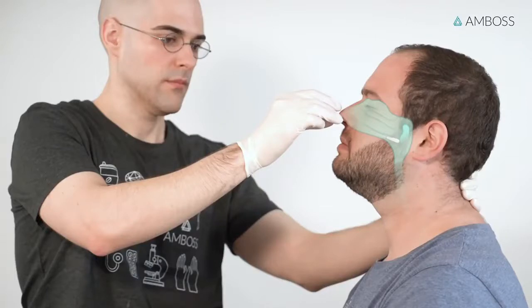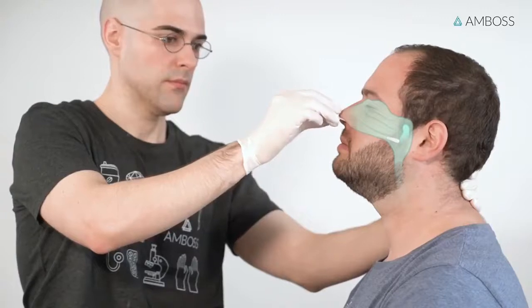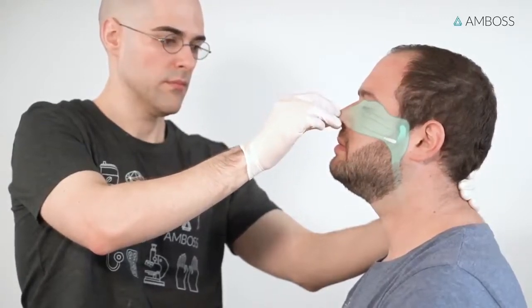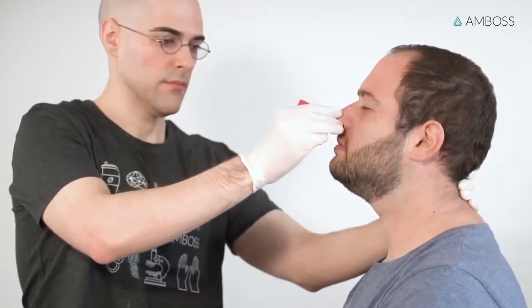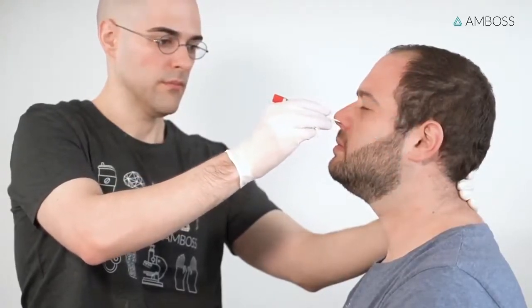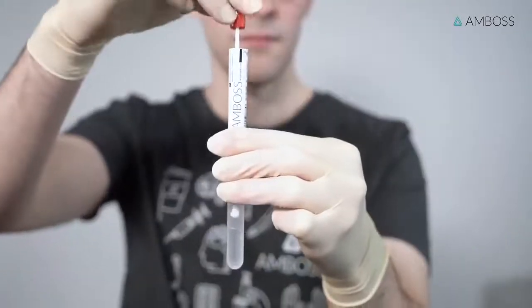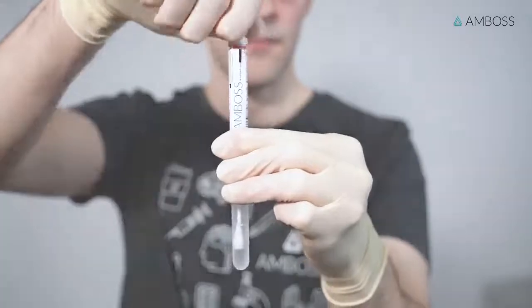nasopharynx. When collecting samples from an adult patient, this corresponds to a travel distance of approximately 5 to 6 centimeters or 2 inches. Leave the swab at this depth for a few seconds while gently wiping the wall by twisting the swab shaft. Slowly and gently remove the swab. Immediately insert the swab into the sample collection tube, which may contain 2 to 3 milliliters of viral transport media.